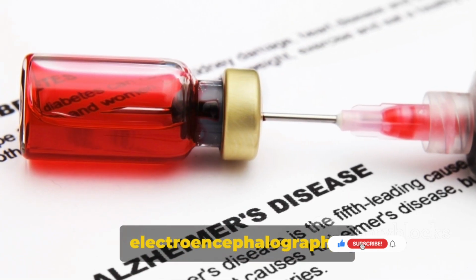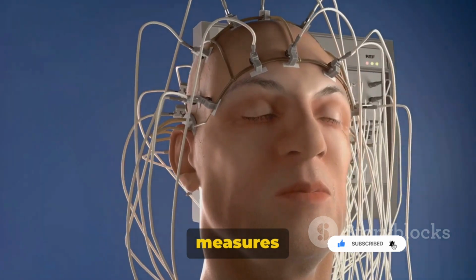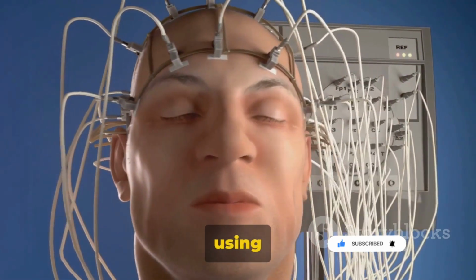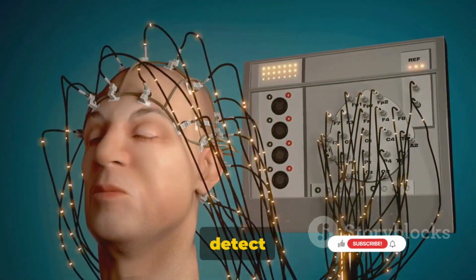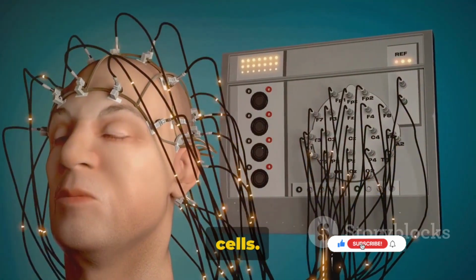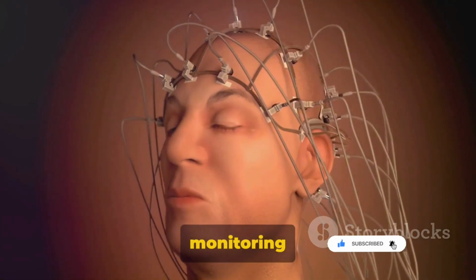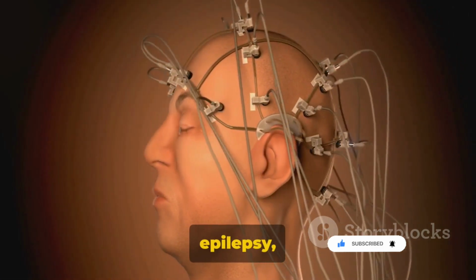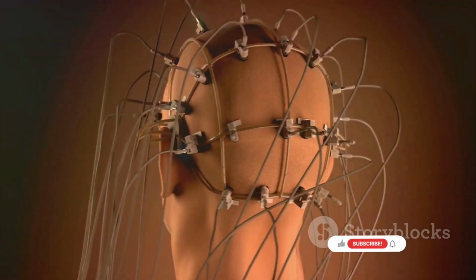Finally, we have electroencephalography or EEG. This technique measures the electrical activity of the brain using electrodes placed on the scalp. These electrodes detect the tiny electrical charges that result from the activity of the brain cells. EEG is particularly useful in diagnosing and monitoring conditions like epilepsy, sleep disorders, and other neurological problems.